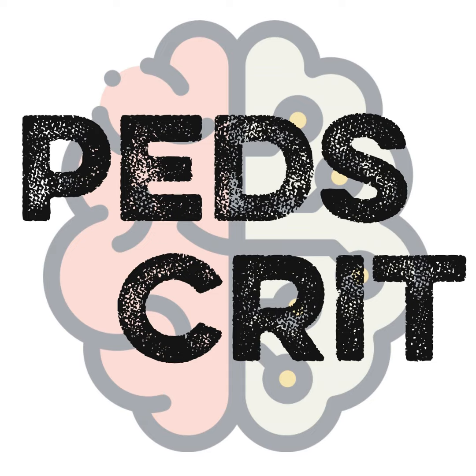Although people broadly understand that it's worse if your driving pressure is higher, of course it's worse. If my FiO2 is higher, that's worse. That just implies that you're a sicker patient. It does not necessitate that targeting it as a parameter is the right thing to do or will improve outcomes. Those are different concepts. Something that's a bad prognostic value, like a high driving pressure, may not be the same thing as targeting a lower driving pressure will improve outcomes.